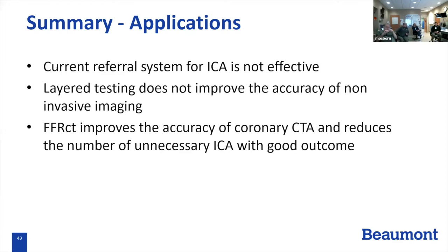So what is the normal dose of contrast that you give the patients? And if you repeat, what's that dose of contrast? We probably give more than we should. Our coronary CTs, essentially the lowest dose that we'll give is 80, but it's mainly dependent on BMI. The highest dose is 120. So 80 to 120, depending on what your BMI is.